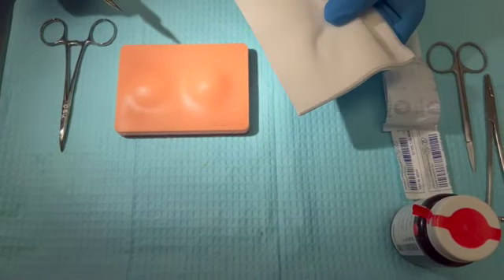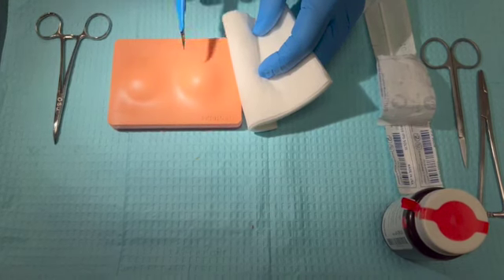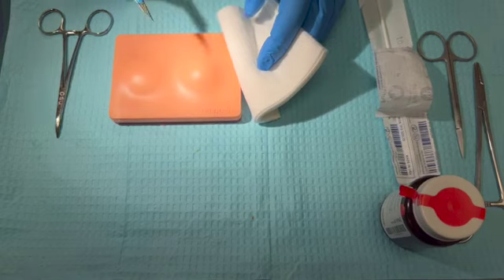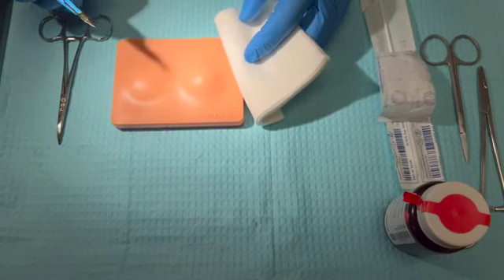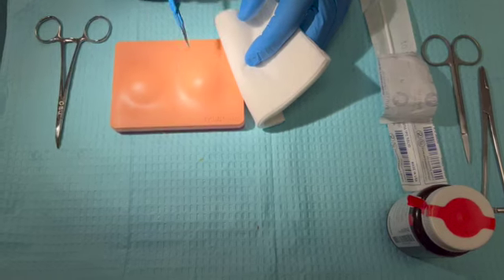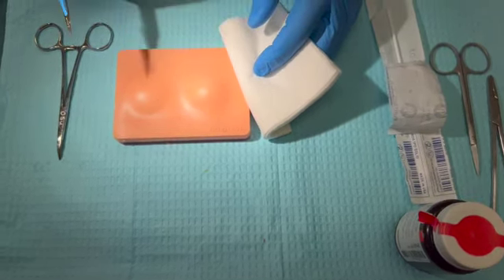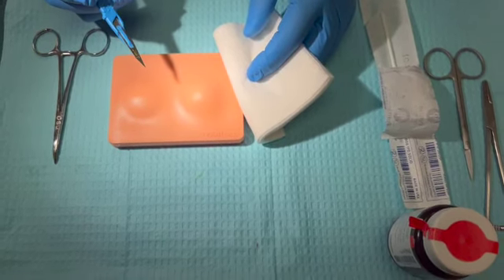I'm going to have gauze available on hand. Being mindful, there's a lot of pressure in this area. Prior to performing this procedure, the provider wants to make sure that you are completely prepared for potential abscess explosion. Sometimes as the incision is being made, there can be an extreme release of pressure, which can result in a propulsion of this material outward.